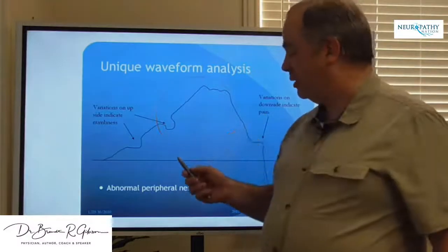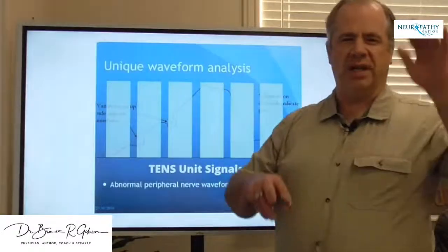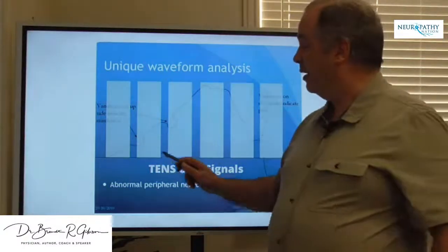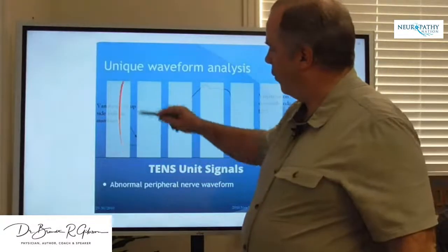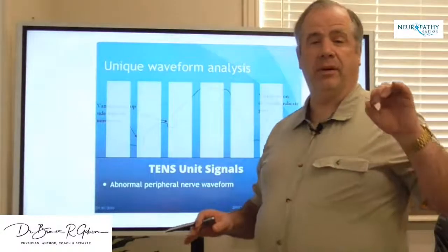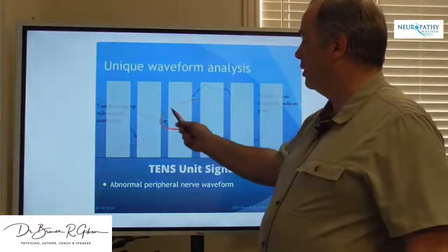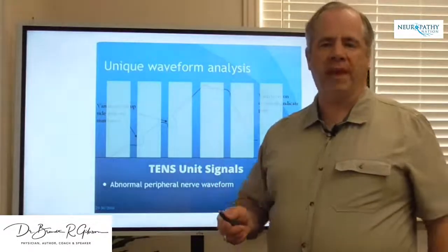So if you had a TENS unit, what you're going to get is a TENS unit has an exact sequence, and it just hits that sequence over and over again. It's happening fast enough that it's overpowering the nerve and just shutting it down. Because of that, you're actually just shutting the pain down. You're repressing the symptoms so you have no pain. But it's not doing anything to help the numbness or the pain here. It's literally just overpowering the nerve and making it so it doesn't work.